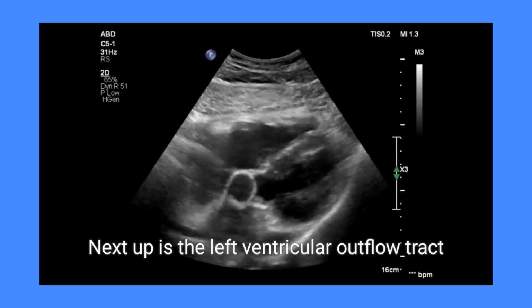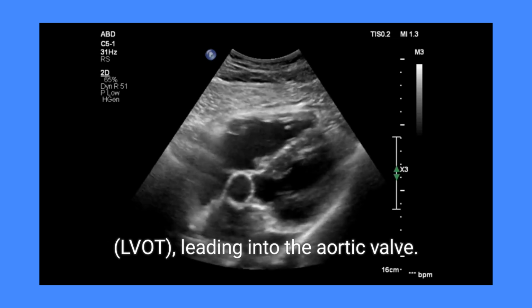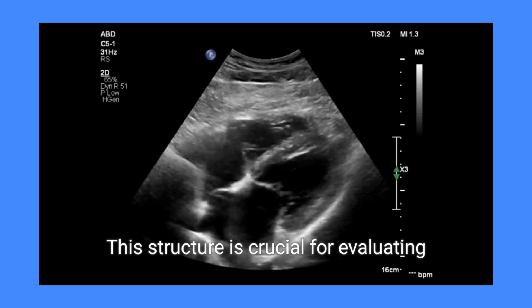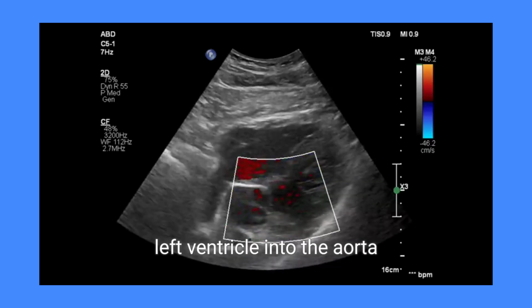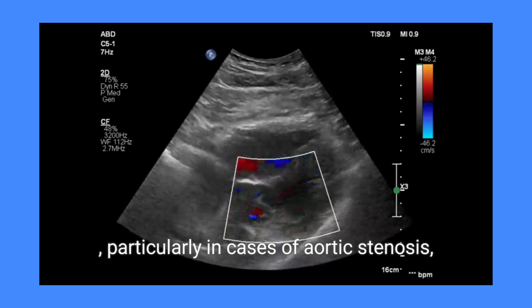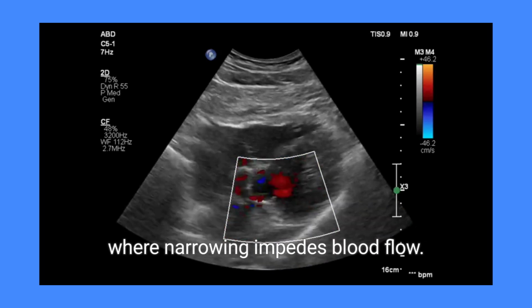Next up is the left ventricular outflow tract, LVOT, leading into the aortic valve. This structure is crucial for evaluating the flow of blood from the left ventricle into the aorta, particularly in cases of aortic stenosis, where narrowing impedes blood flow.